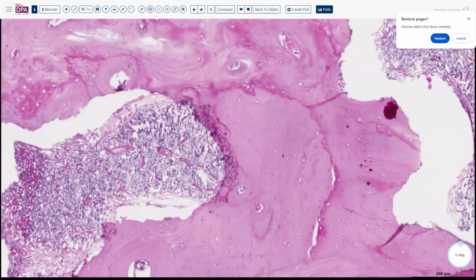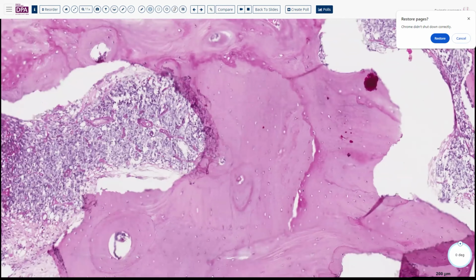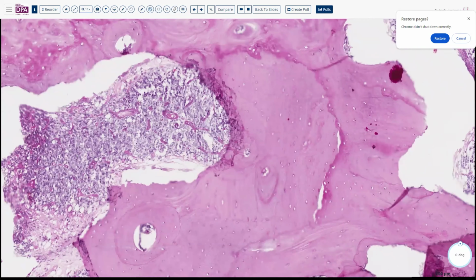However, it can be very useful when you've got a lot of obscuring blood and you want the red cells to fall back out of the picture. The PAS stain does not highlight any red cells, and so they will essentially be invisible to you, whereas you will be able to see a little bit more of the underlying structure and get an idea of some nuclear features.